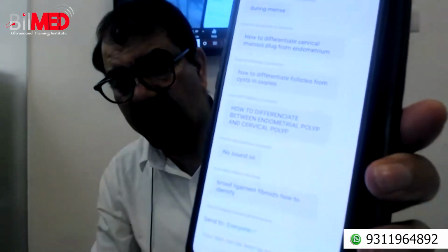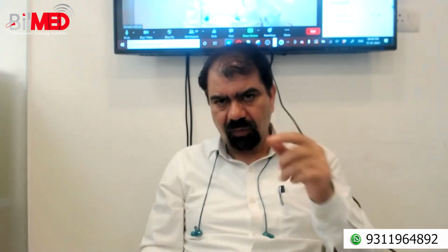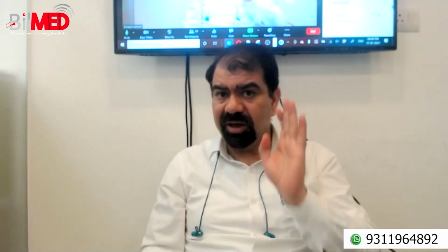Very simple. Now see, this is the question over here. If it is in the cervix, it has to be the cervical polyp, and if it is beyond the isthmus, high up past the isthmus, it has to be the endometrial polyp. This thing should not come in anybody's mind, when to label it as an endometrial or a cervical polyp. Of course, where the cervix is starting, we just discussed. We have to see the isthmus and the mucus plug, where it is ending and where it is starting. And if we are not getting the mucus plug, not in each and every patient will we see the mucus plug, then we will be relying on the isthmus.